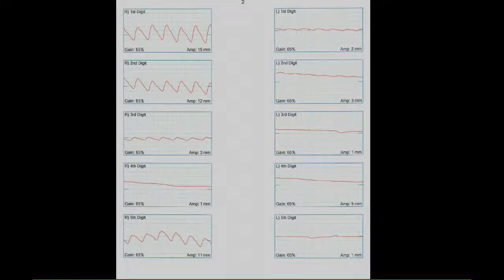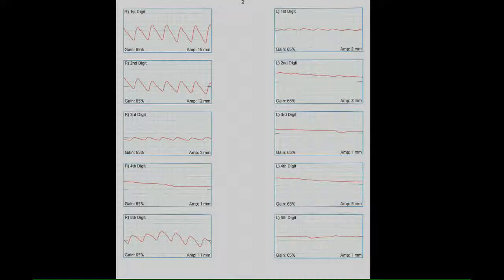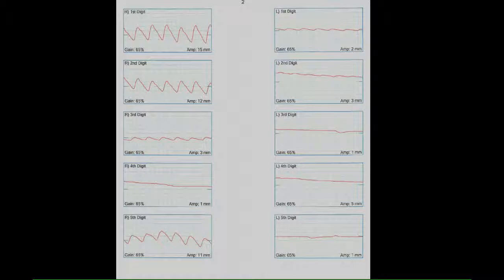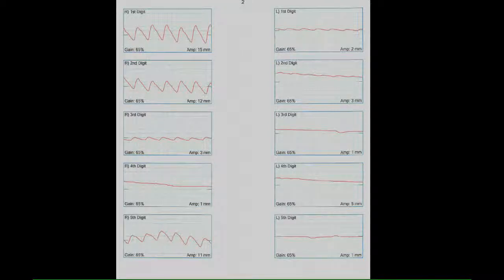After a period of rest, digital waveforms are obtained and assessed for any signs of recovery. This particular patient demonstrates limited improvement in flow after five minutes of rest. At this point, the hand should be re-warmed to avoid injury and limit patient suffering prior to patient release. Thank you very much.